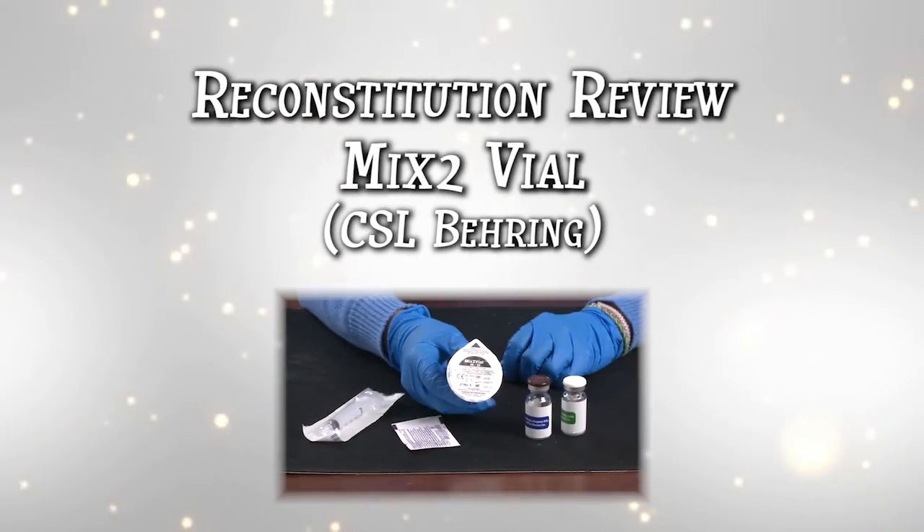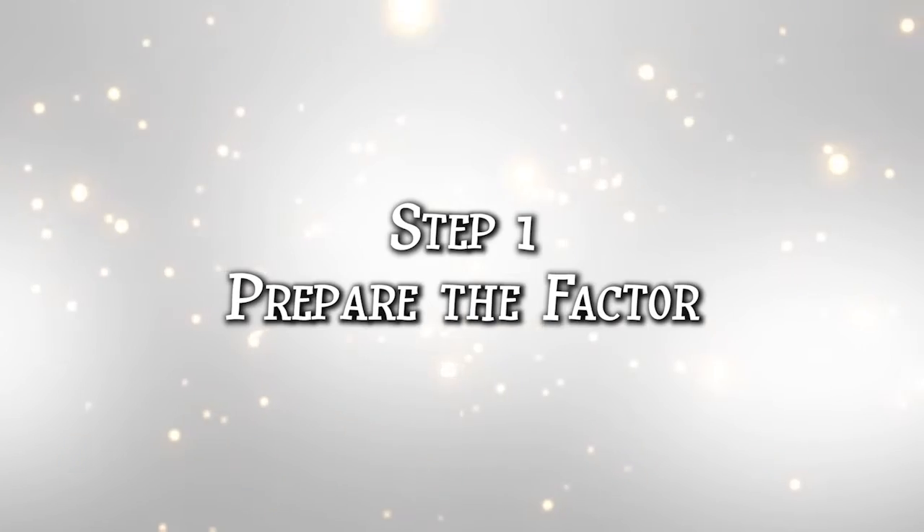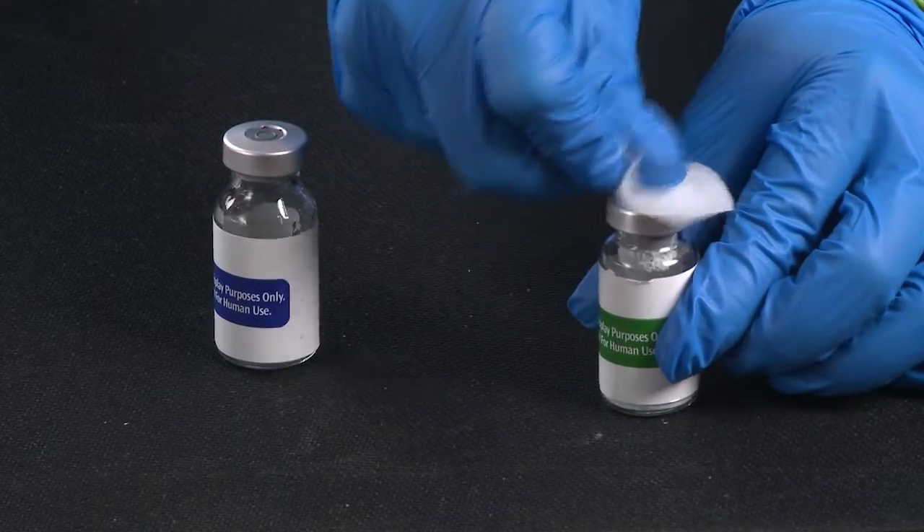Welcome to Reconstitution Review with the Mix 2 kit, which can be used with CSL Behring products. You're going to prepare your factor. First, wipe the top of each vial with a swab and wait for it to air dry.